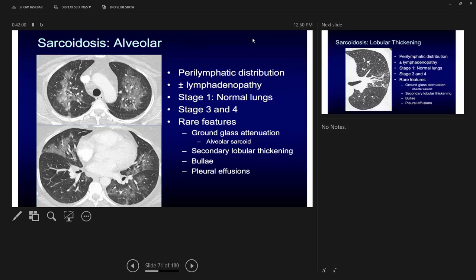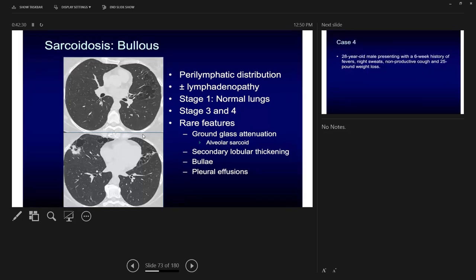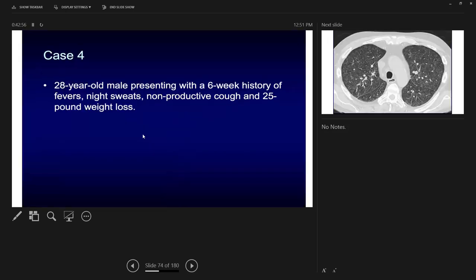There is also alveolar sarcoidosis, where you see ground glass rather than nodules, but biopsy still shows non-caseating granulomas. CT may show prominent interlobular septal thickening with fibrosis due to lobular involvement. Endobronchial sarcoidosis can cause an obstructive pattern with air trapping or emphysema, and patients may present with obstructive lung disease on PFT. Cyst formation can also occur, often secondary to fungal infection.